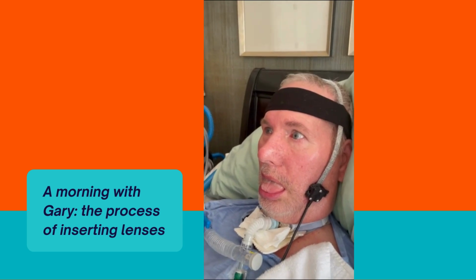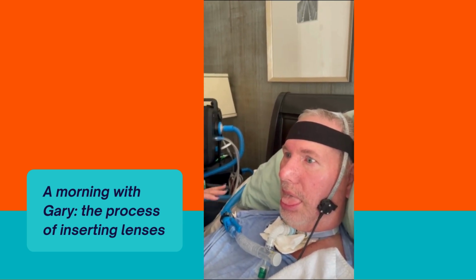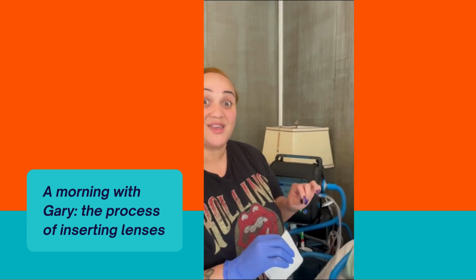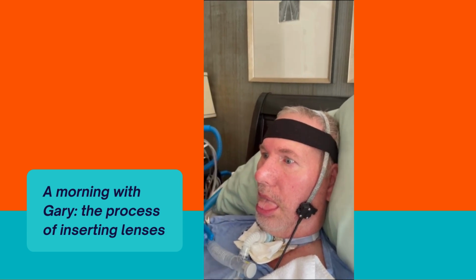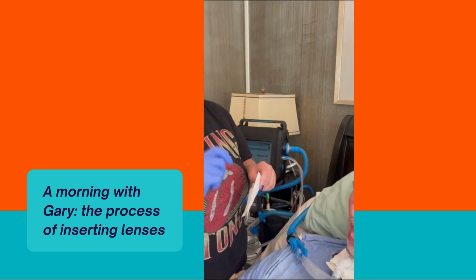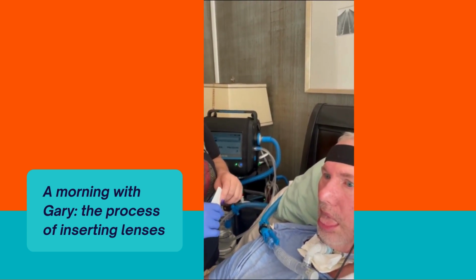So the last thing we do is he'll say blurry, and sometimes it's not the fact that something is on the contact, but it's the fact that we have too much eye drops in his eye. So what we'll do is, sometimes during the day, he will ask for an extra eye drop. How many do we usually put, one eye drop or two? It's 1 drop on each eye, and in a 12-hour span, we might do it 2 to 3 times.